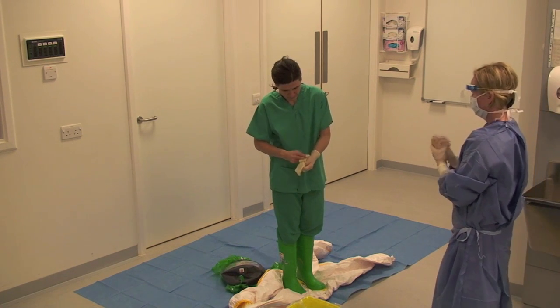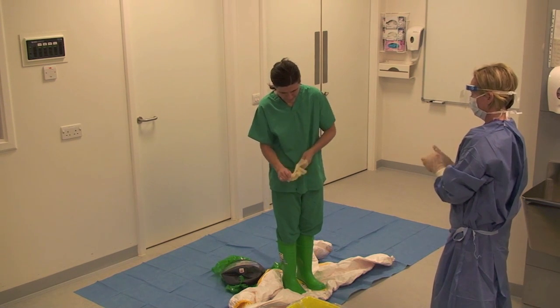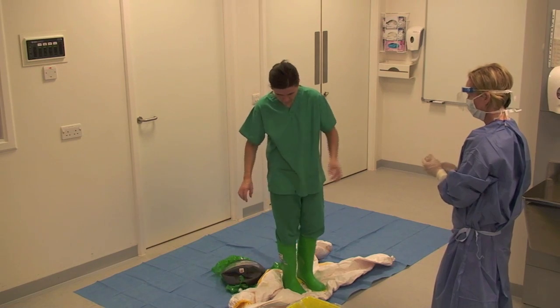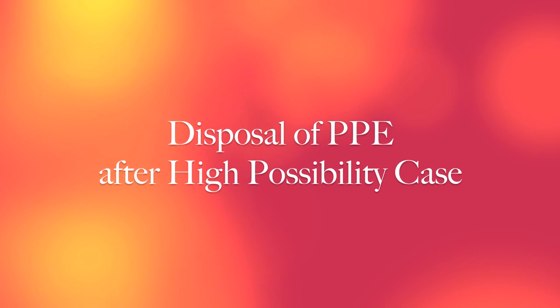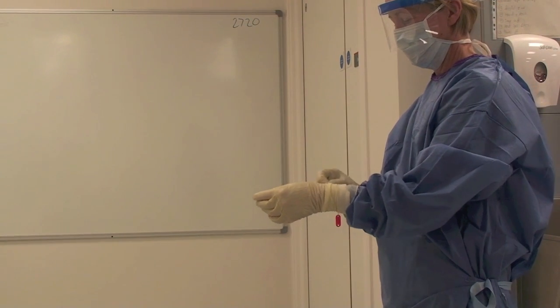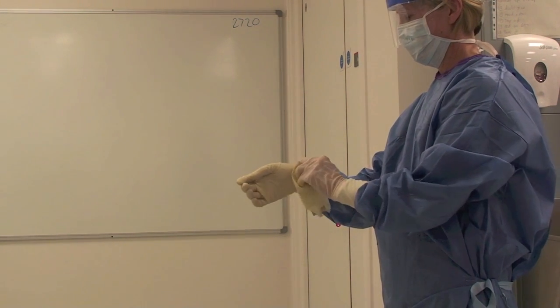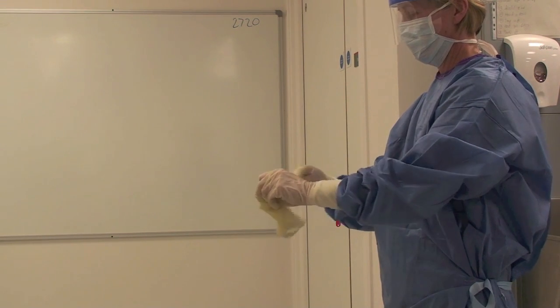The healthcare worker steps off the blue sheet, removes their wellington boots or shoes and performs hand hygiene as before. The buddy applies alcohol based hand rub to their own gloved hands, rubs it into the gloves and then removes the outer pair.